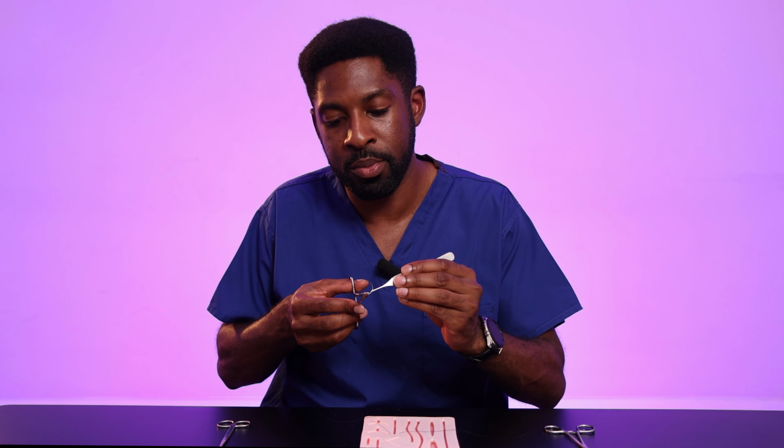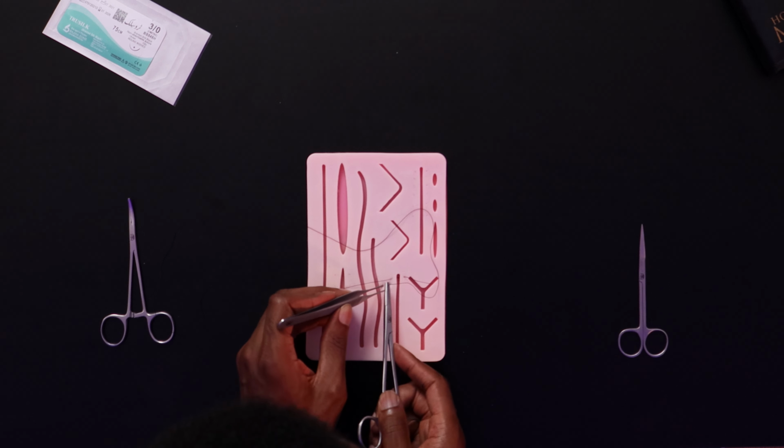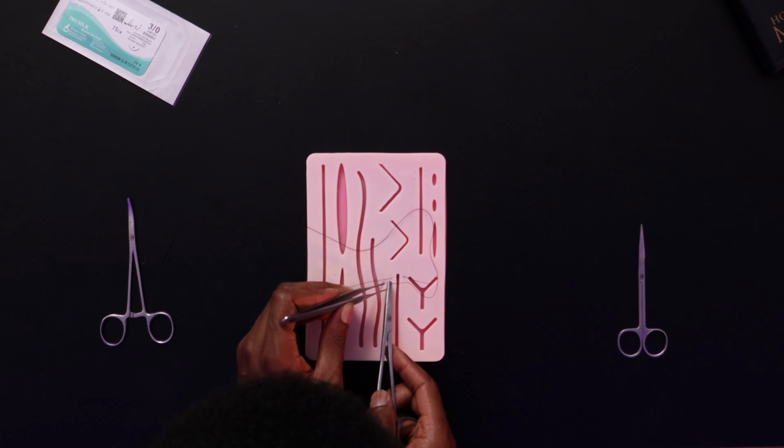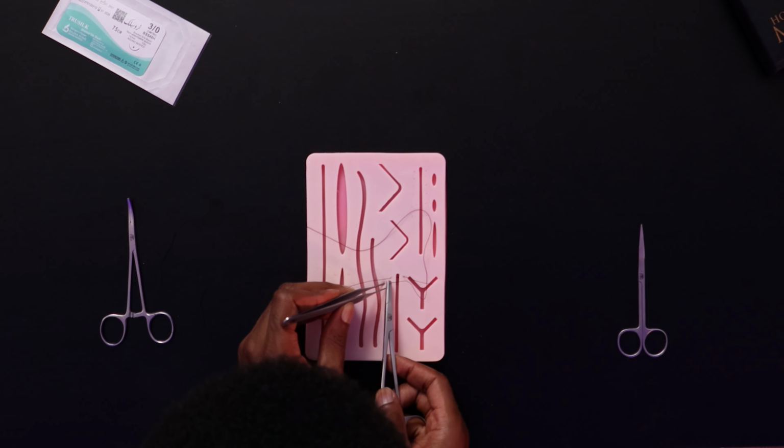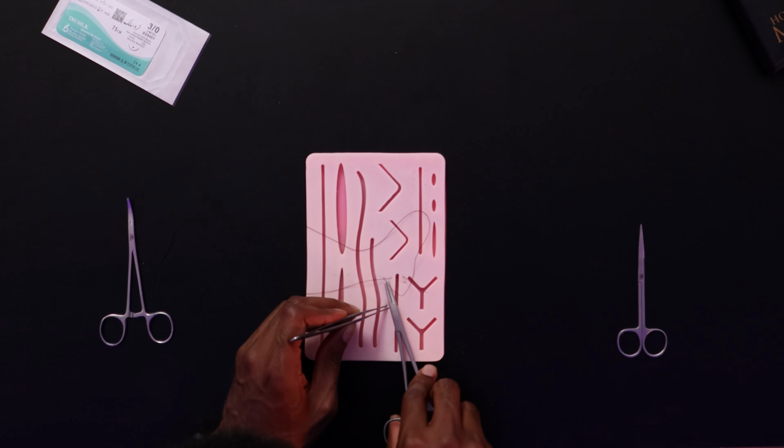You remount your needle using the forceps, pointing the tip downwards so that you can perform the backward suture pass. Again, needle at 90 degrees to the skin. Pass through to the opposite side, and the same distance. And pass the needle through.